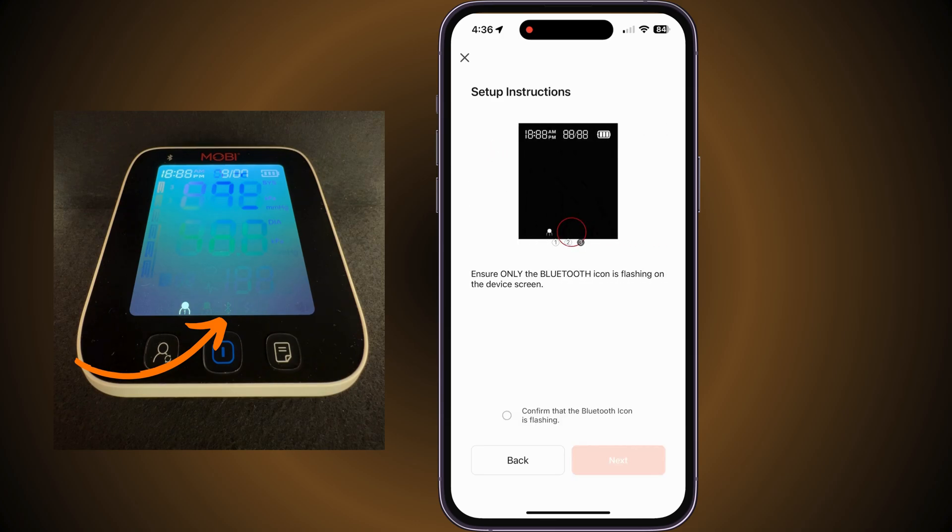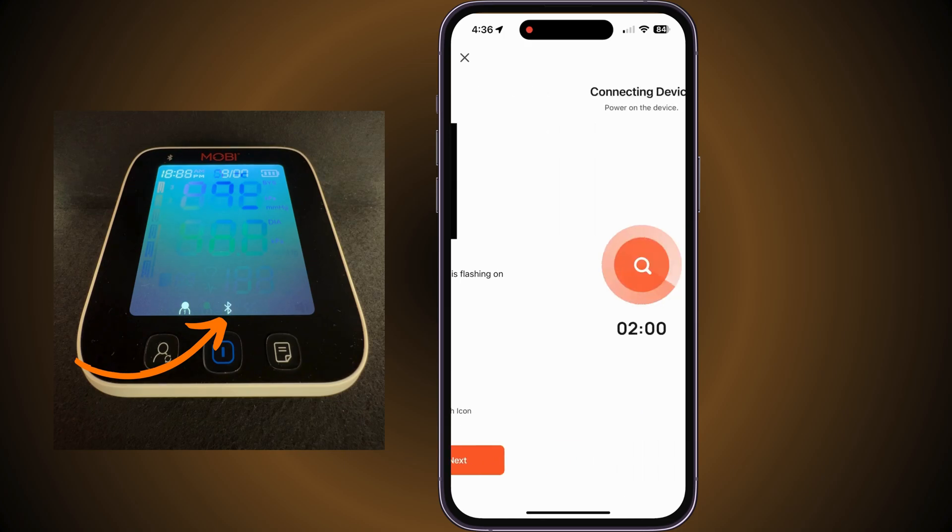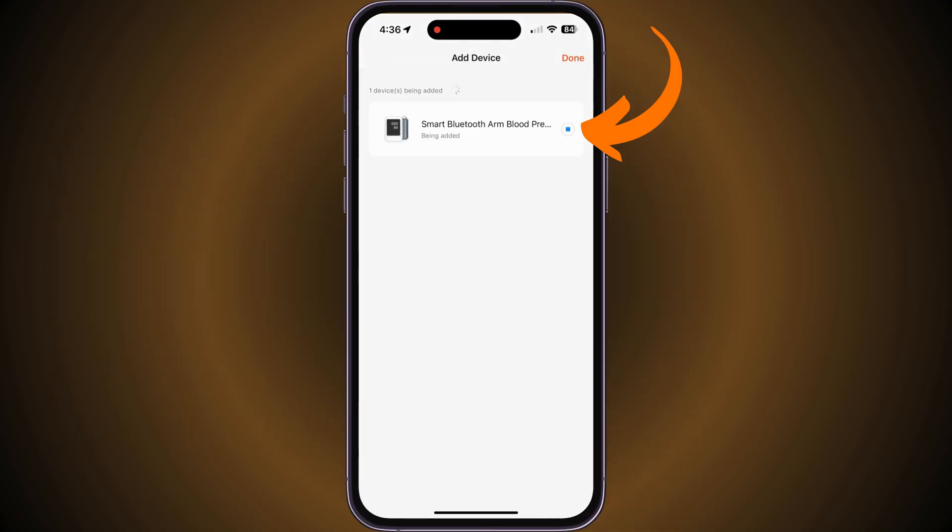Ensure the Bluetooth logo is flashing at the bottom of the device's screen. Once flashing, continue forward by tapping Next and your device will connect. Once connected, tap on the blue button indicator, then tap on Done.